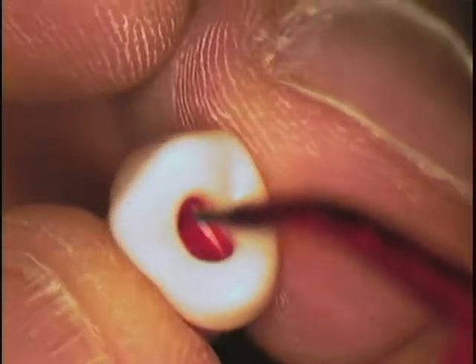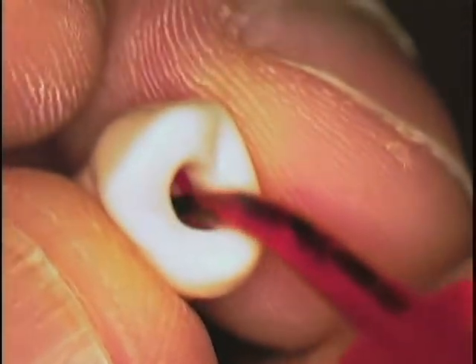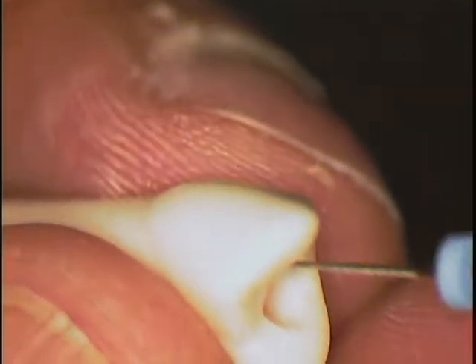So keep going. Go back to my patency file. Before I do that, lubricate it. So I would lubricate every time you change and go up to a next file. I would lubricate in there. It's just a safety thing. And then just make sure you're patent. So go in with your file and you get all the way through, no problem.